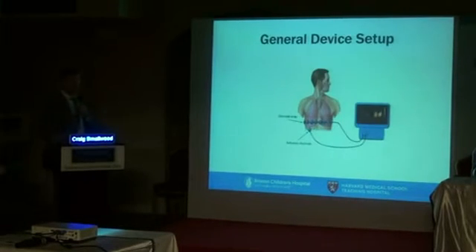So to remind you, this is the general setup. We have our patient. We purchased this box. Unfortunately, it wasn't free, but we've got it on loan or purchased it because we believe in the technology. We've placed the electrodes circumferentially around the chest. We have good contact with the machine. Each electrode is working correctly. During the workshop this afternoon, I'll teach you how to do that with one device we have here to demo.